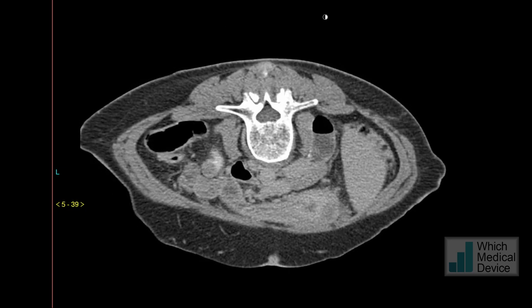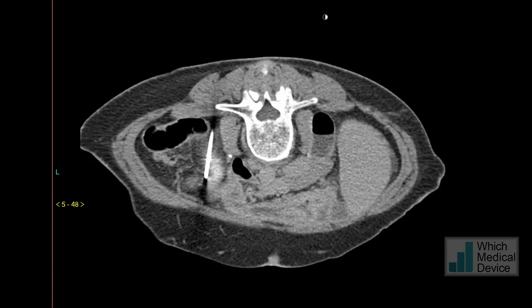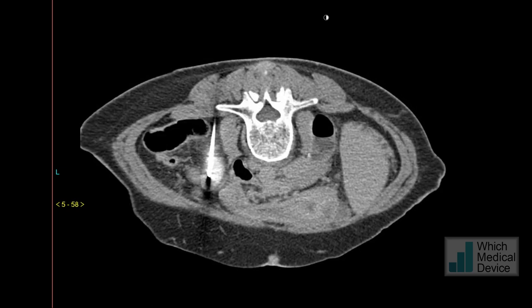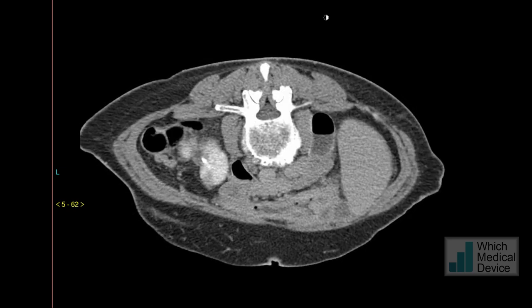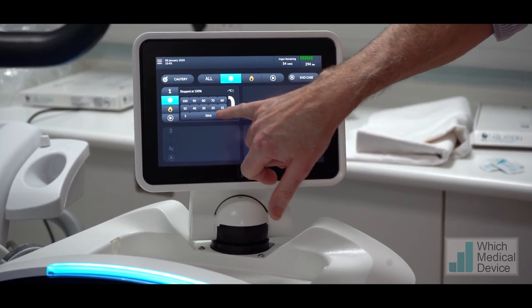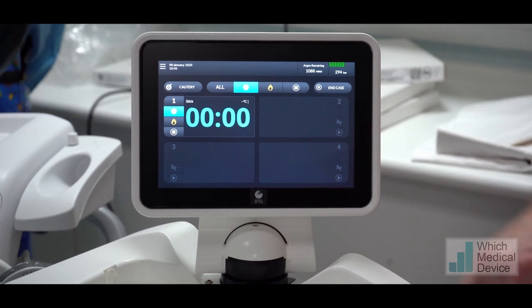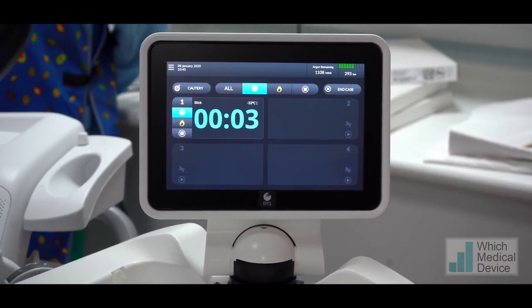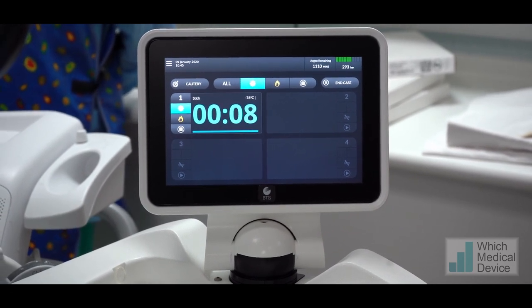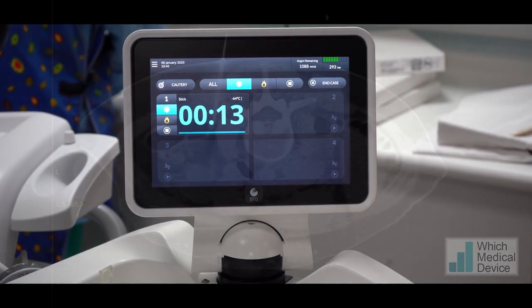Once we're happy that the needle is in position, we perform hydrodisection, because we need to make sure the small bowel is moved well out of the way of the cryotherapy field to avoid damage. We advance the needle right into the middle of the lesion. We then use the stick mode on the ablation machine, which uses a small amount of argon gas to cool the tip to about minus 60 or minus 70 degrees, fixing the needle in place whilst we place the hydrodisection needle — a 22 gauge needle — through which we inject saline to displace the small bowel.